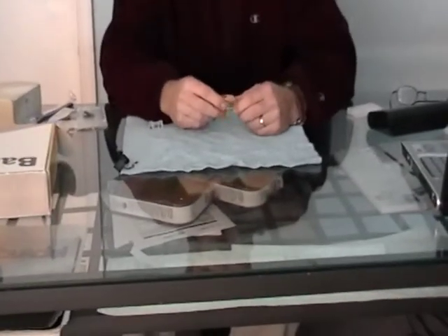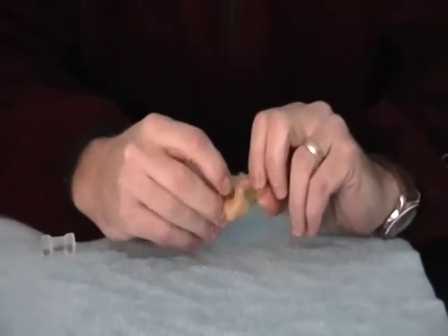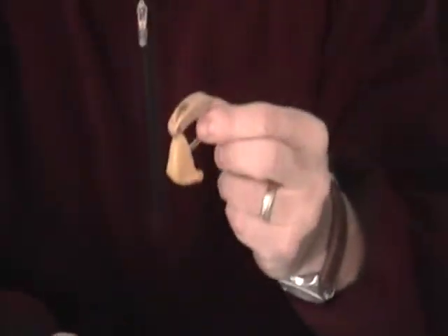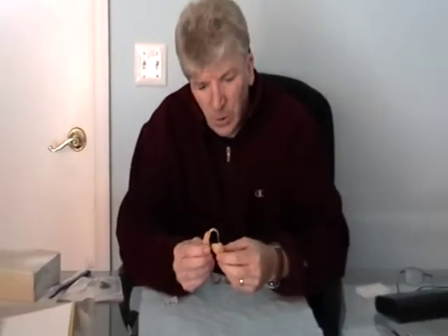One of the things I wanted to show you — if I have my cameraman Vince zoom in — here's an example of an old Phonak hearing aid that I have owned for many years. I just want to give you an idea of the size and the actual angle and the way the model of the hearing aid is designed.